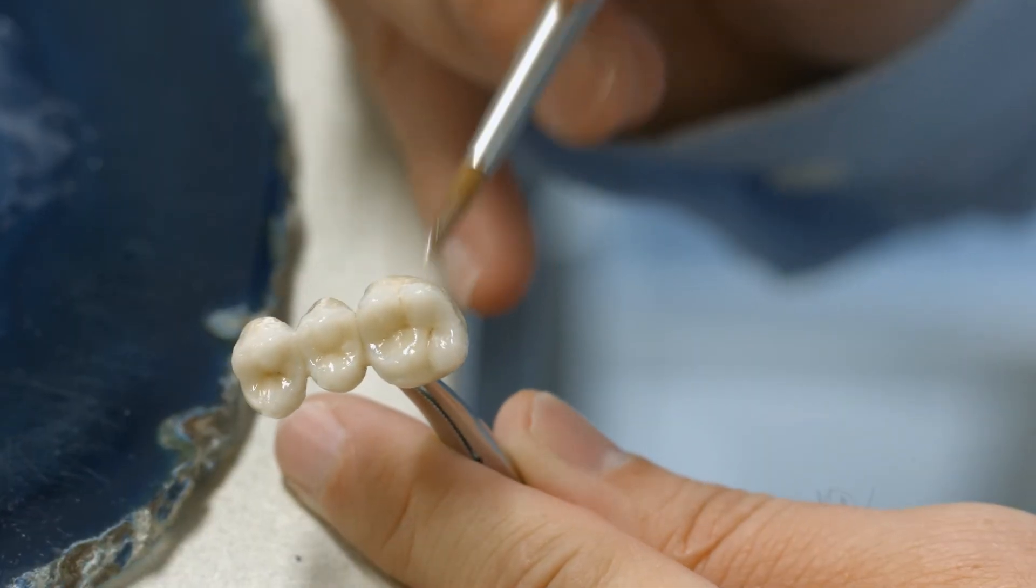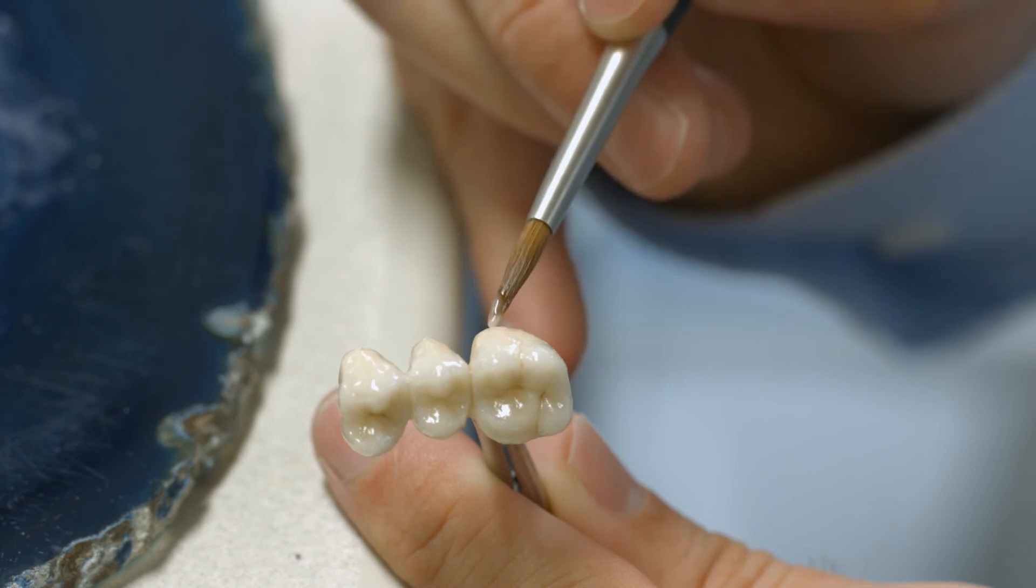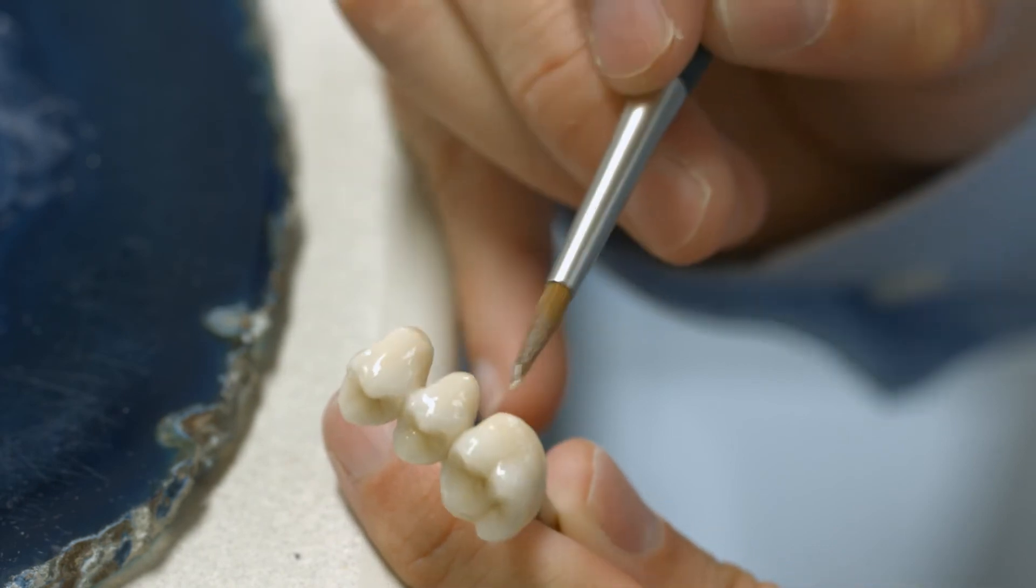If needed, shade adjustments can be made on the applied glaze using IPS Ivocolor shade and IPS Ivocolor Essence materials.